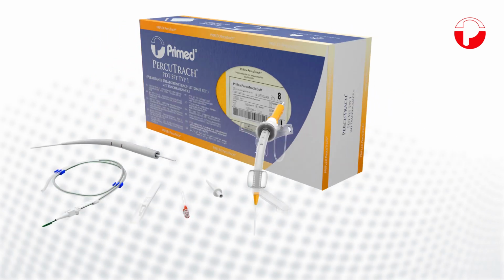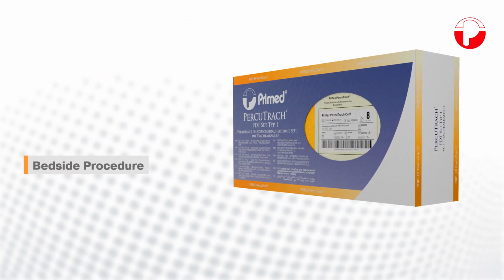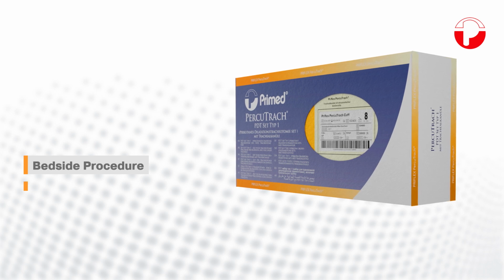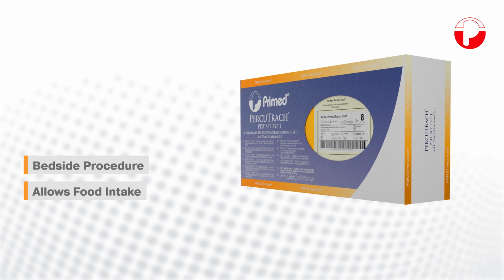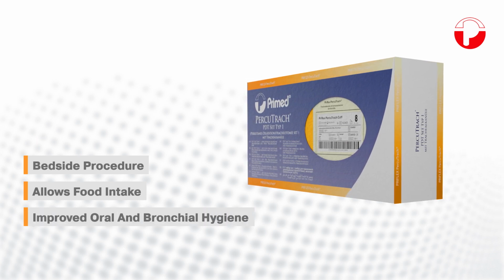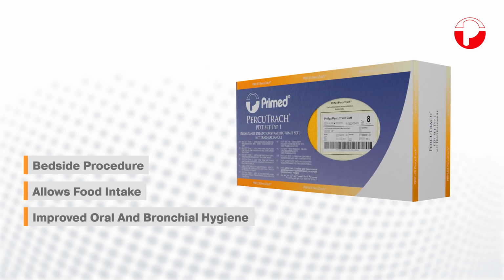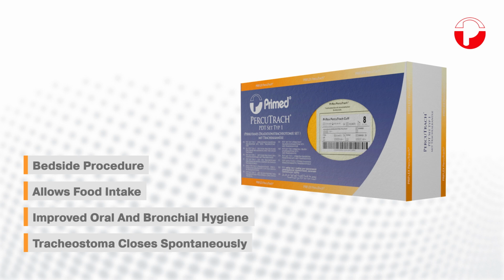Dilation can be performed gently and at the bedside in ICUs. Unlike with intubation, the patient can take in food orally during ventilation, and oral and bronchial hygiene become much easier. In addition, the tracheostoma created by dilation spontaneously closes after treatment has been completed.